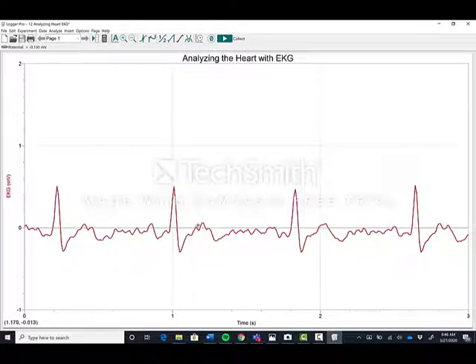Yeah, my T wave, I don't know why it's hitched here. Maybe I'm dying. Maybe I have the virus, hopefully not. The T wave right here is going to be the pinnacle of where the ventricles are repolarizing or relaxing. And then you go into this calm period.